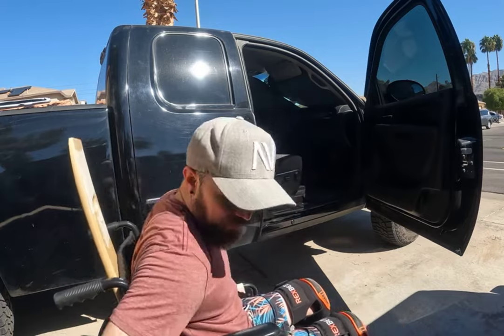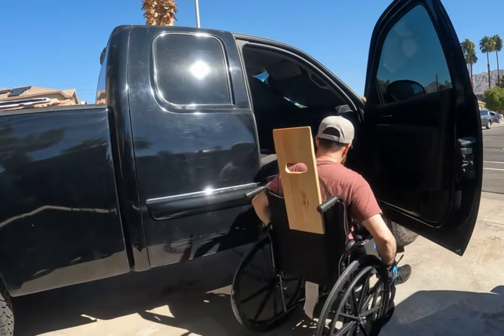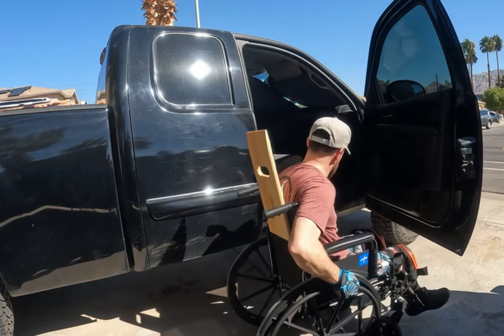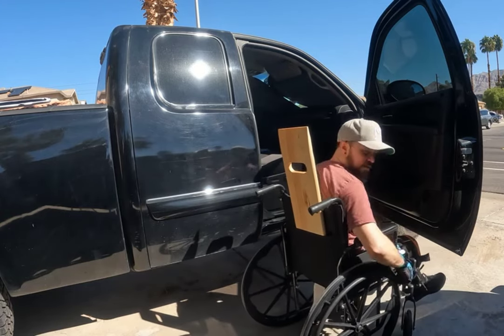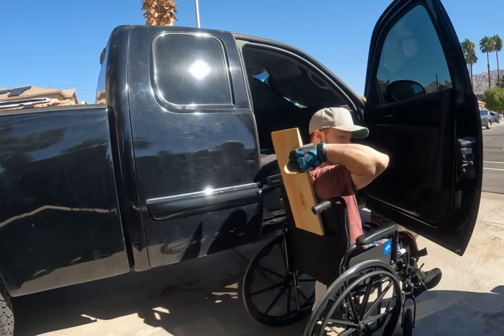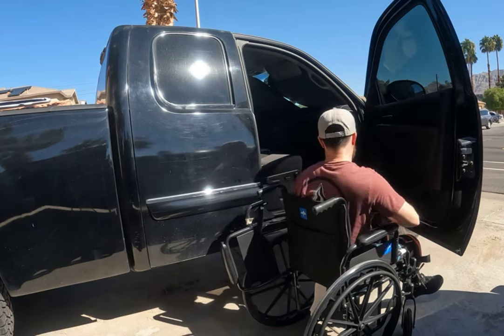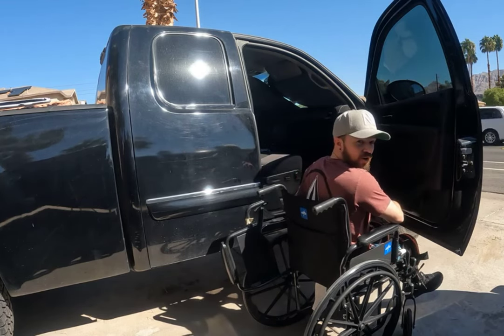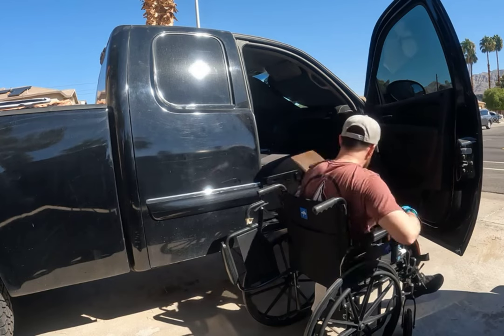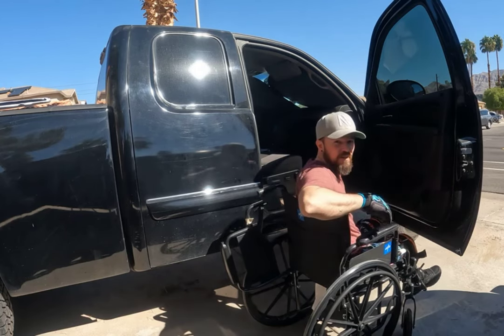First, I come up to the truck and approach it a little bit sideways, about where I like to park it. I get my trusty X-slider board out, put the armrest up, and slide the board right up against the carpet, right underneath the actual chair, so that it's sitting like that.